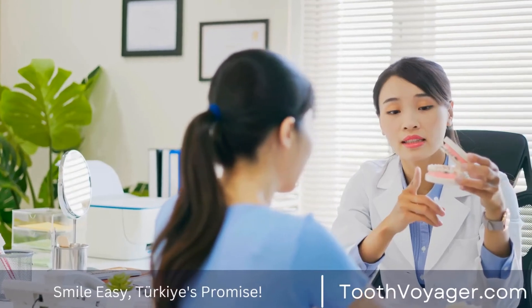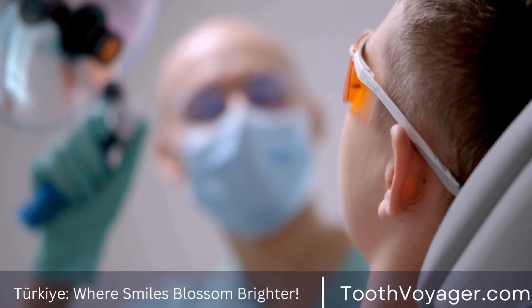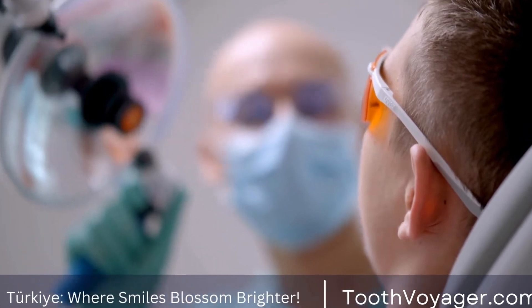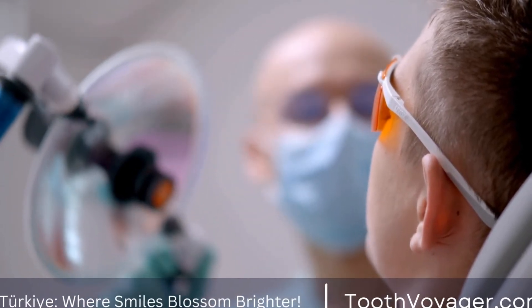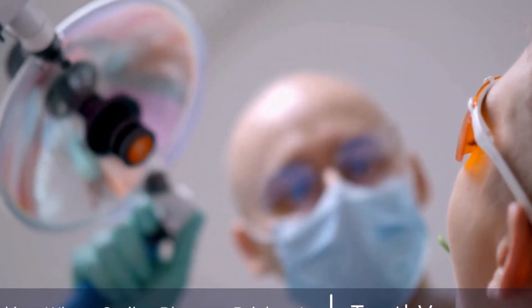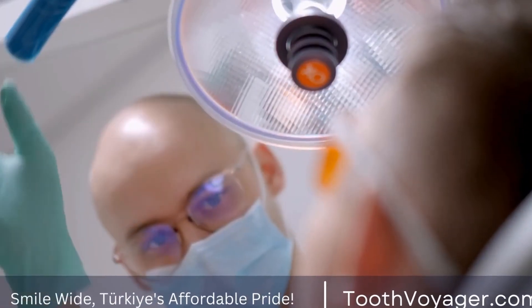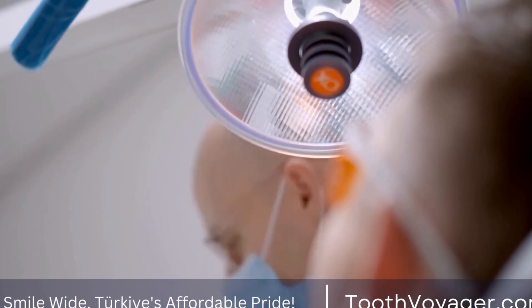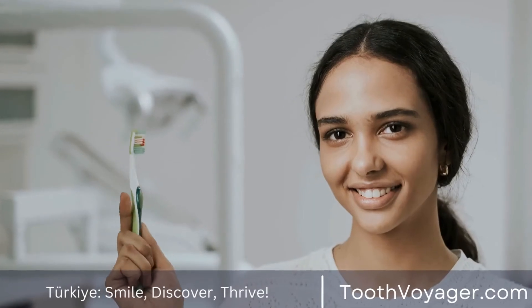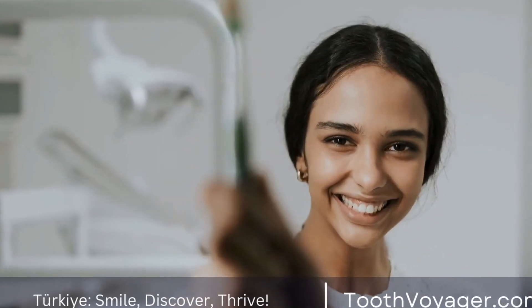Final adjustments and care. After the veneers have been placed, the dentist may make final adjustments to ensure they look and feel natural. They may also polish the veneers to give them a smooth, shiny finish. To maintain your veneers, it is important to practice good oral hygiene and visit your dentist regularly for checkups.